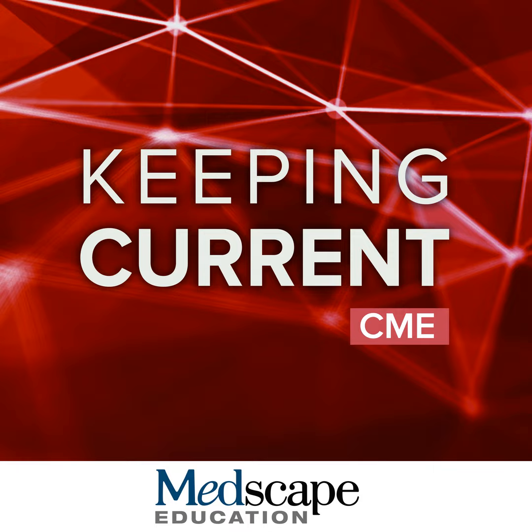So what about use of gadaxetate in patients who have chronic liver disease or cirrhosis? There's a large use case for gadaxetate for detection and diagnosis of HCC. As a background, let's think about how HCC appears with extracellular contrast agents. If we look at our arterial, portal venous, and delayed phase, this is the curve that we expect for our background liver parenchyma, where the peak enhancement happens at about portal venous phase and trickles down after that. And then the HCC peaks in arterial phase and then really dips down on portal venous and delayed phase.